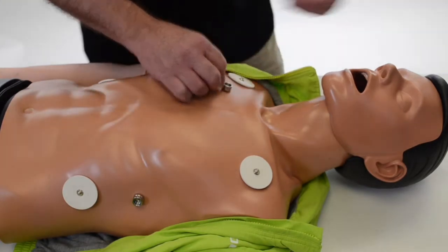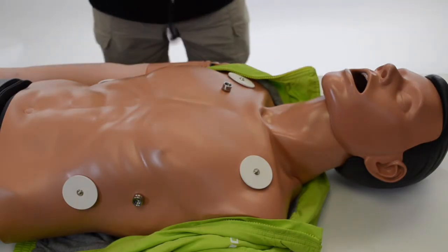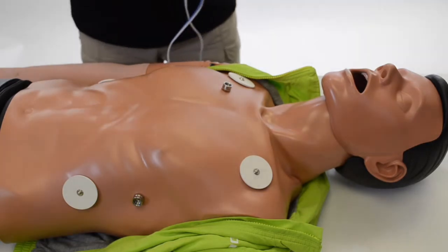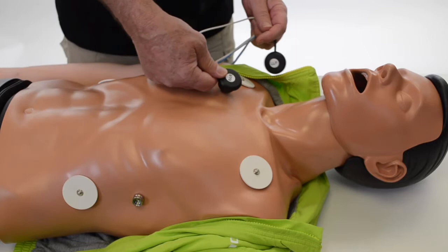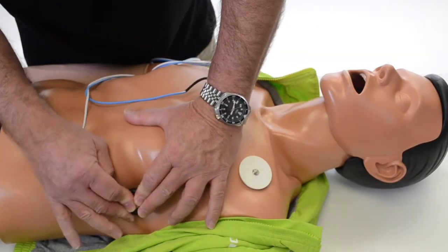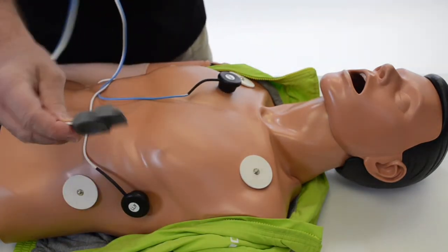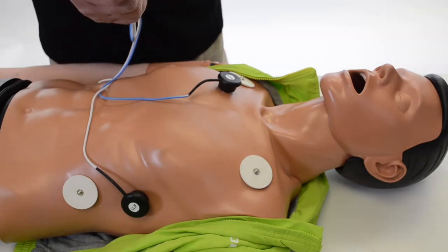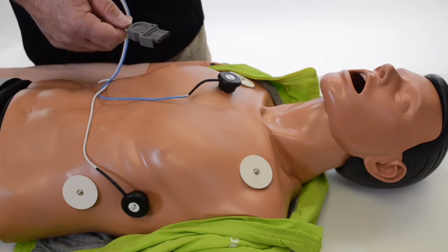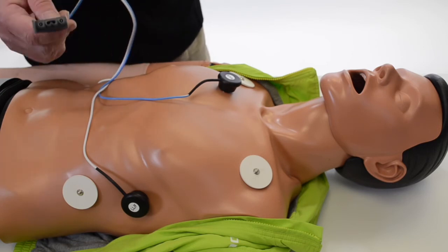The major manufacturers have training cables. These particular training cables are for LifePak 15s. You take the cables and snap them into place, and then you hook this up to your defibrillator or AED. That allows you to not only monitor the waveform from the mannequin but also discharge energy, again up to 360 joules.